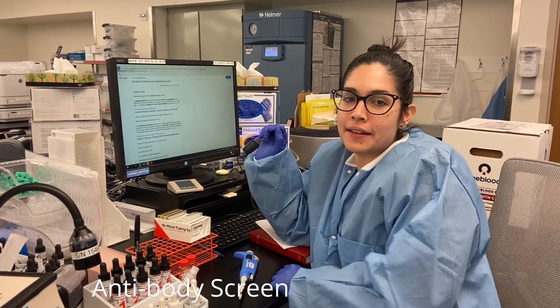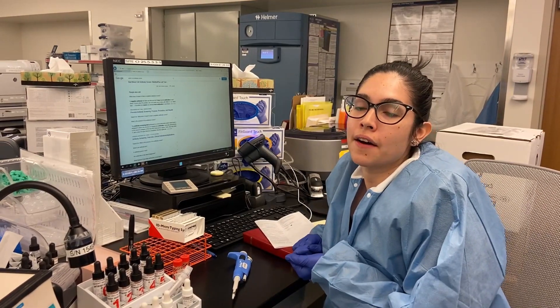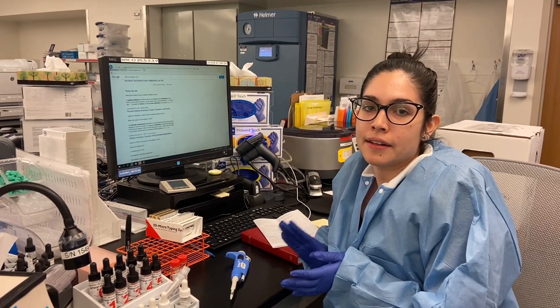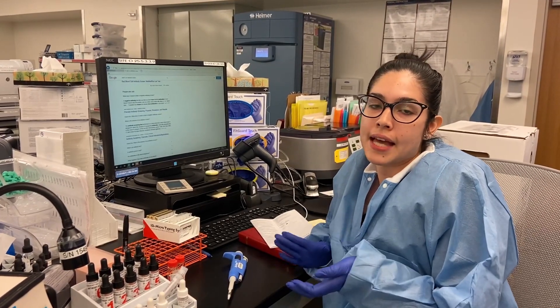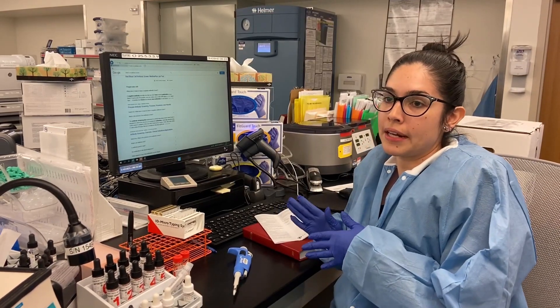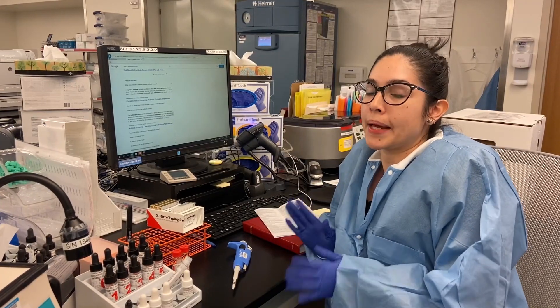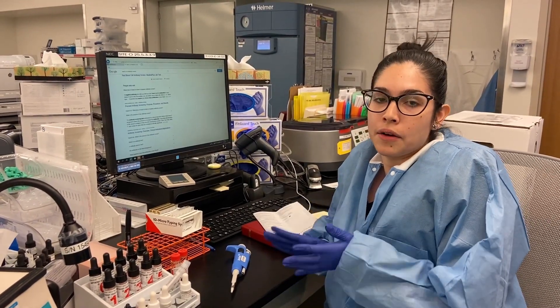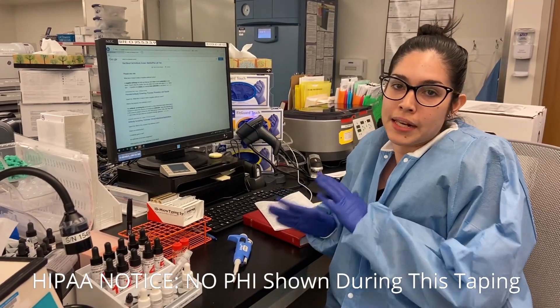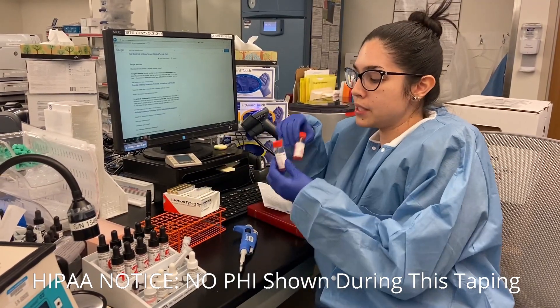Today I'm going to show you how to do an antibody screen. An antibody screen is a test done when there might be a chance of a patient being transfused. It's usually done as part of a type and screen — type meaning finding what the patient's blood type is, and screen is screening the patient's serum to see if there are any unexpected antibodies that aren't part of the ABO blood group system. We have two screen cells: screen cell one and two.